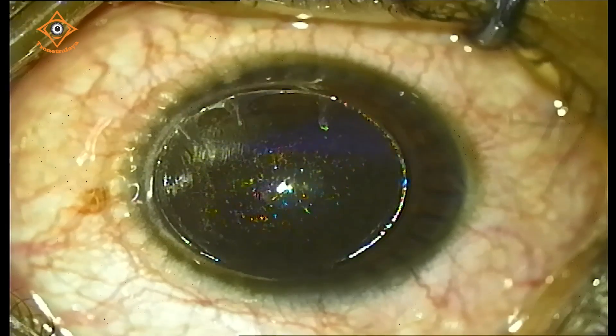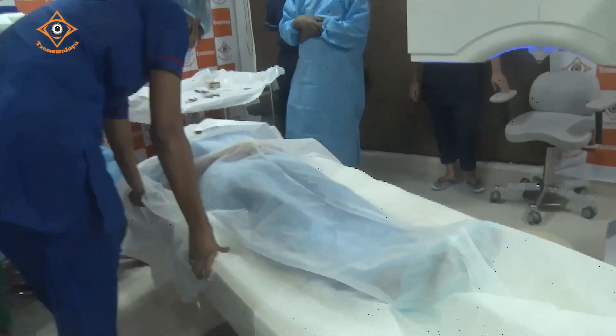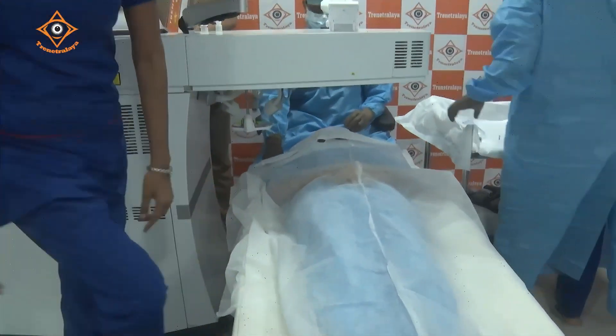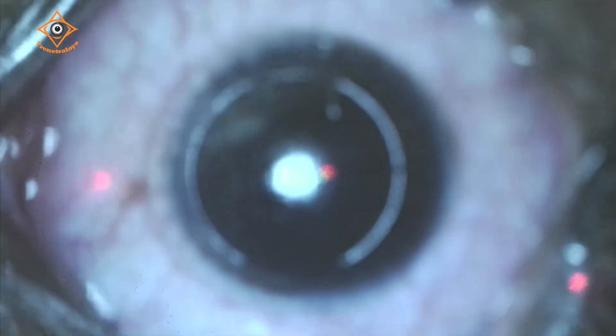Now we will take her to the MEL90 for the excimer laser treatment. The same bed is swiveled onto the MEL90. Is it possible to open up the flap under the MEL90 microscope since you have not opened it yet? There is a little bit of a time gap. I usually prefer to make the laser flap and then on the LASIK platform open it up so that there is no gap.